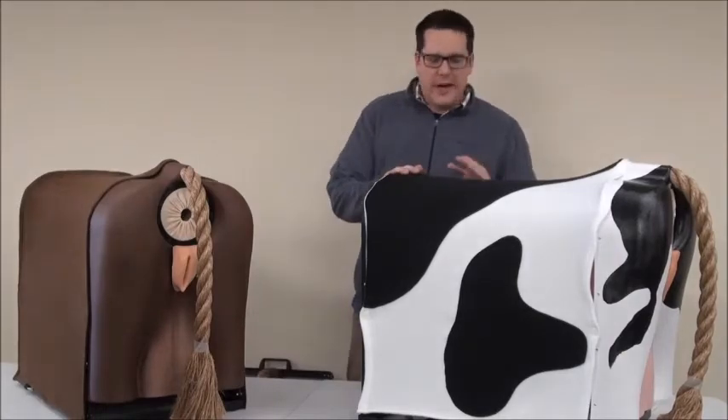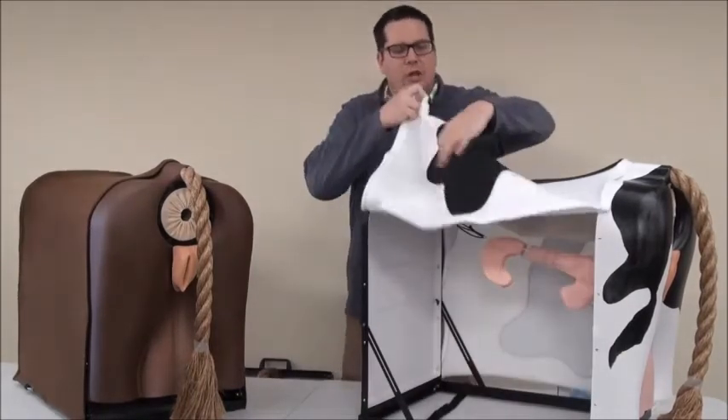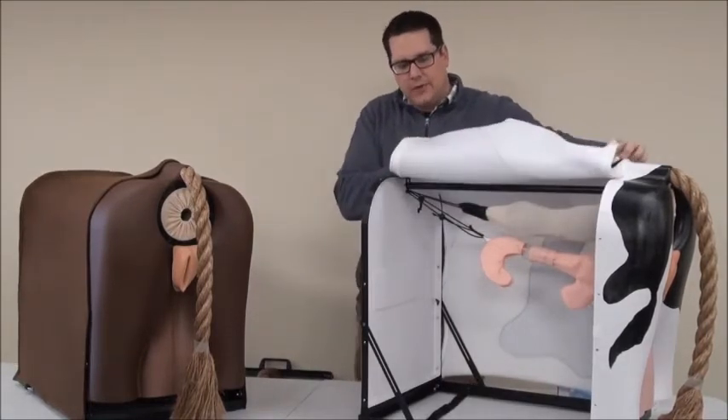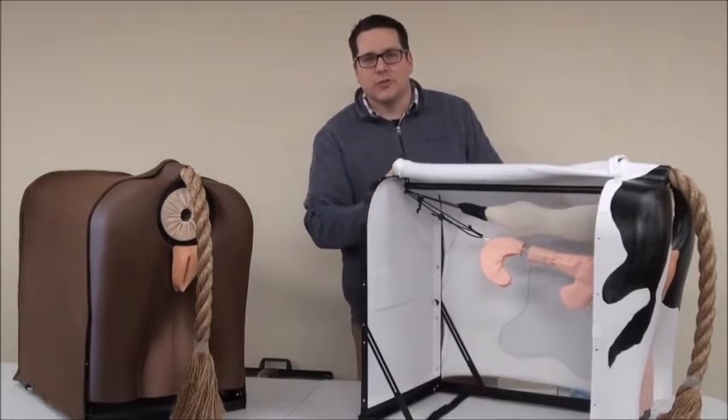Now let's look at what it actually does. The great piece about this is that the hide actually opens up here, so you can do assessment both with the hide down or by opening it up, allowing students to see inside. Let's look a little closer.